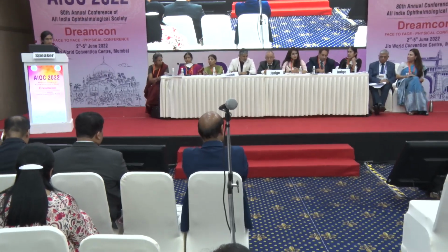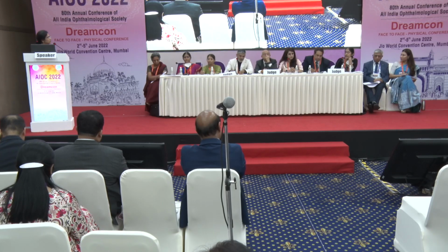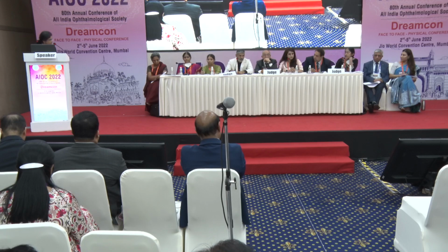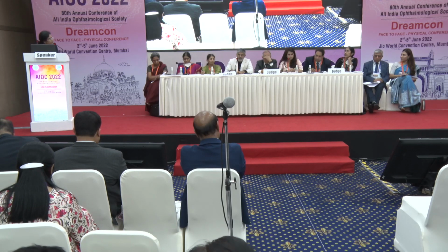So, Dr. Pallavi, I have some reservations on this. The intention is very nice and you've captured it very nicely, and congrats for coming to this stage. Thank you. But an asymmetric bow tie, number one, is not always an indication of keratoconus. Skewing, asymmetric bow tie, under a particular limit can be there in the normal population as well.